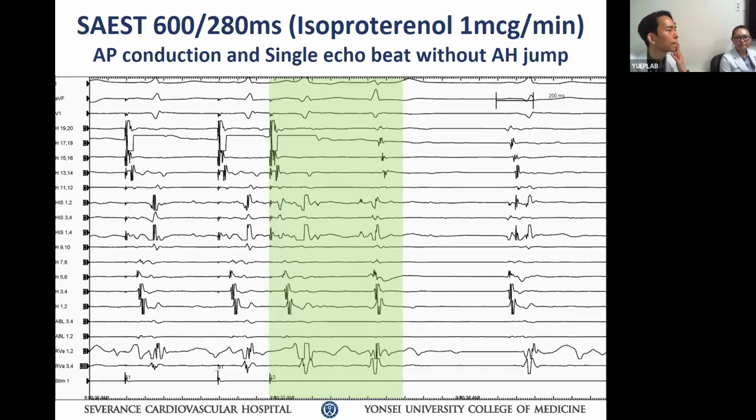Please, then you can explain that, please. It's more like concordant. So the last paced beat is pre-excited, right? So we don't see His bundle there. So it's conducted through the maybe fusion, maybe pathway.